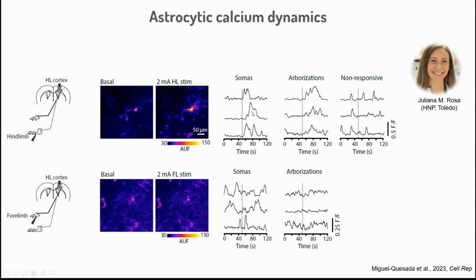This is some of the quantifications, how you see the astrocyte and the different traces of calcium. Normally for neurons they are different, because these are wide since they are astrocytes. For neurons, they are much shorter. But basically what you can do is see the response of the brain to a systemic stimulation, in this case electricity in the paw.